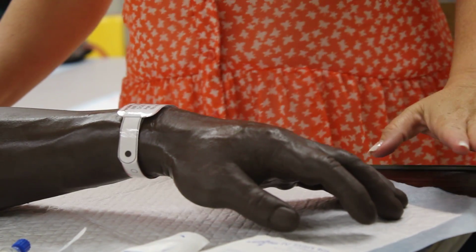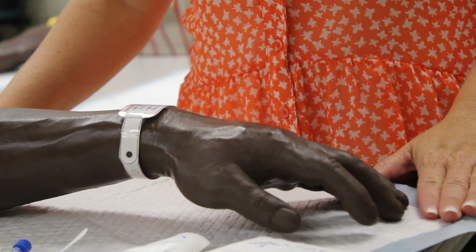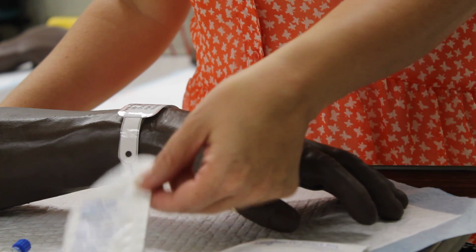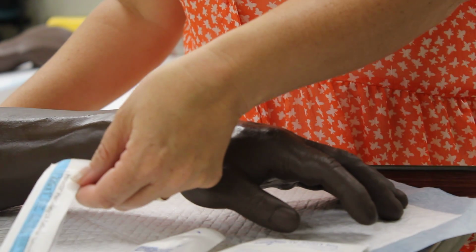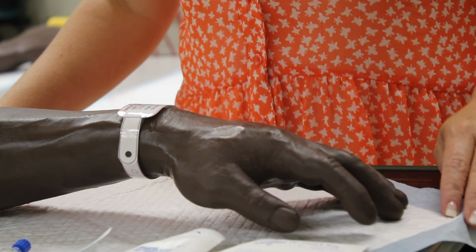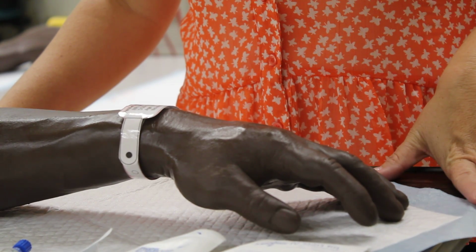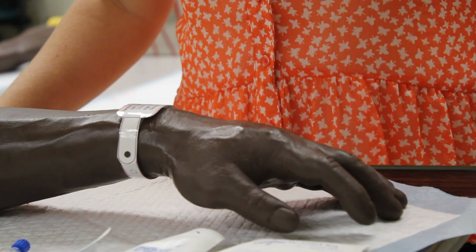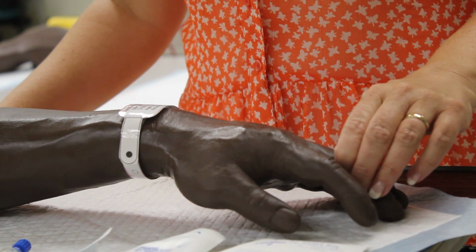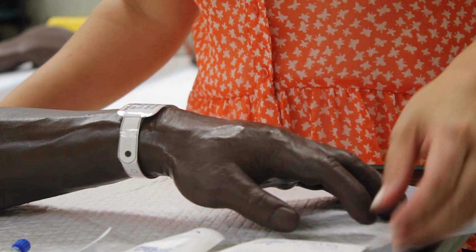Okay, today this video segment is going to cover an IV insertion. The equipment you will need is an IV start kit, an extension set, an IV catheter, and your normal saline solution. We're going to expect that you verbalize that you have checked your orders, that you have washed your hands, that you have identified your patient, and that you have explained the procedure to your patient.